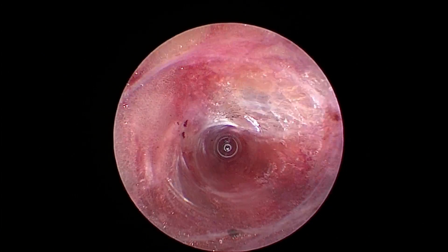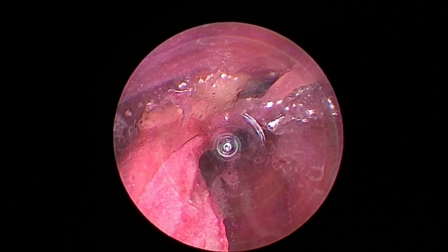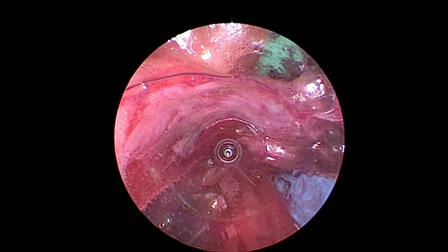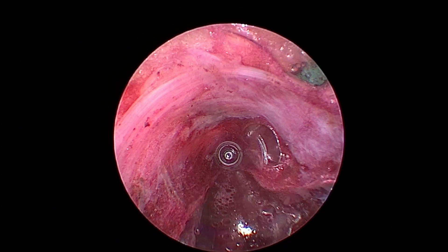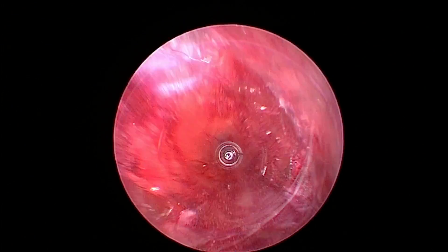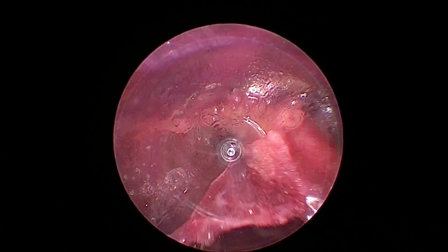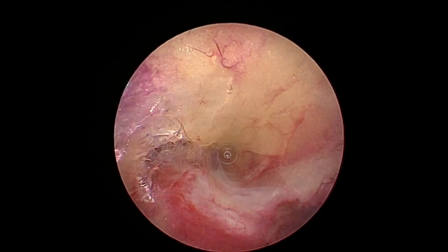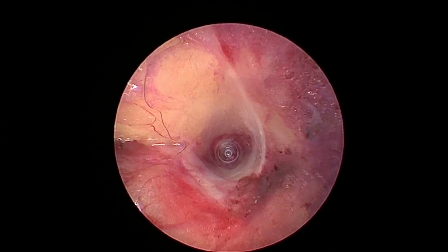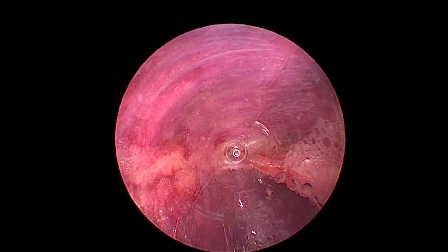Here I'm just making a little window lateral, and I go posterior. I have my space now to cauterize and cut that adventitial tissue — and maybe there's a small branch in there too, so I'm taking that also. I have some space now below and above, and I'm getting close to where this tunnel will start to open up a little better and not be as tight. But I still remain lateral with my dissection. There's a tiny branch — I'm just going to make a tiny window.